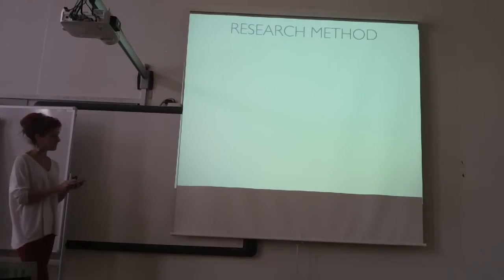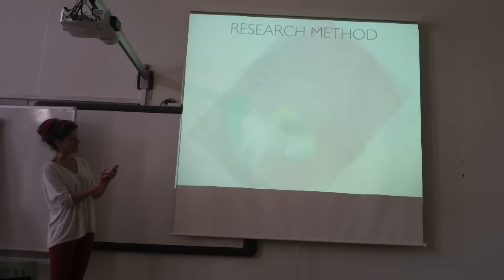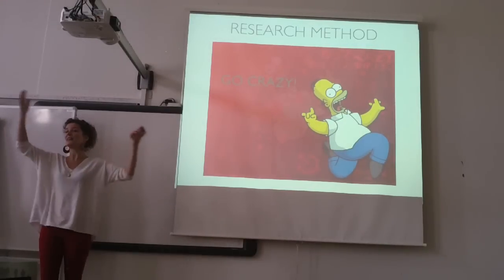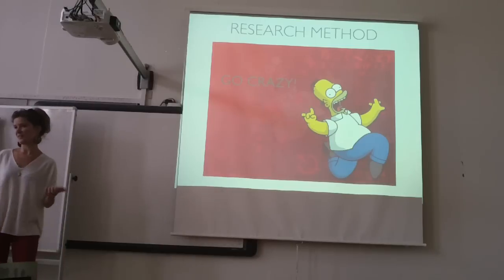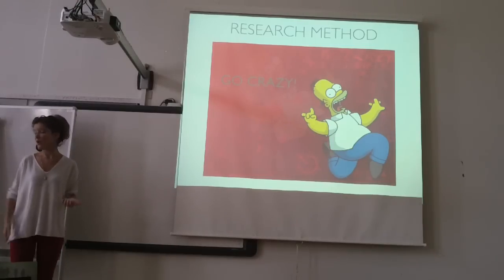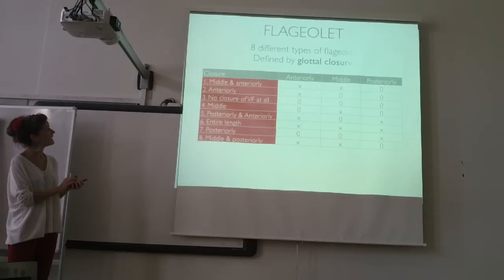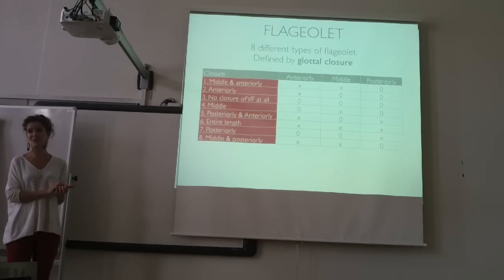This is our research method. There was no protocol yet, so I just said, go crazy, freewheel. So all these singers have been producing lots and lots of flageolet, and we have just looked at them. What is happening? What did we see? And we saw 8 different types of flageolet defined by the glottal closure.